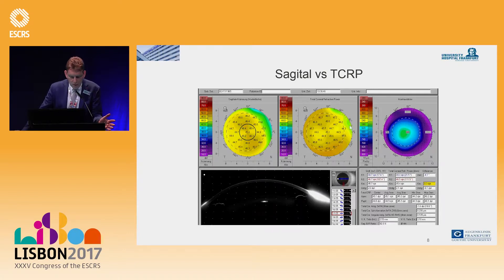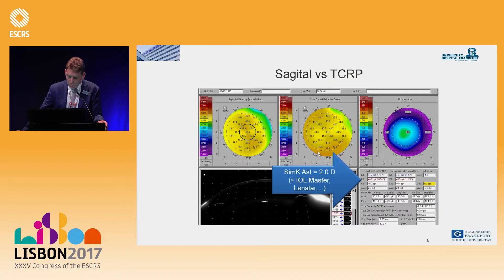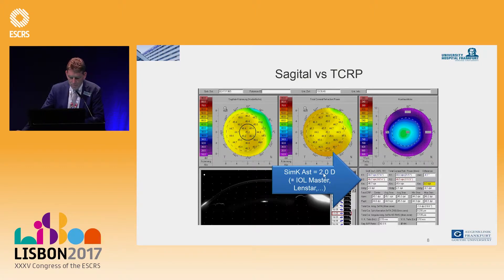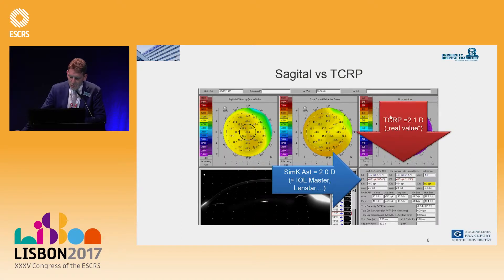Here is an example from our clinic: on the left is the sagittal map looking at the anterior surface, and on the right is the total corneal refractive power. A thickness map is also provided by the Pentacam measurement. Looking at SIMK, which takes only the anterior surface, we measured 2 diopters of astigmatism — the same as would be obtained with IOL Master or Lenstar — while the total corneal refractive power at this zone was 2.1 diopters, a difference of only 0.1 diopters.